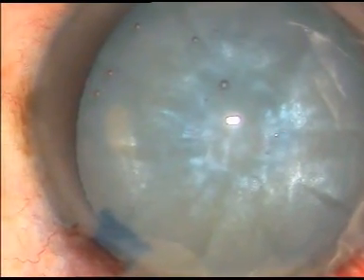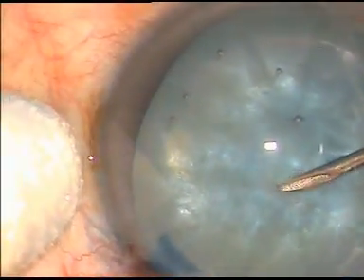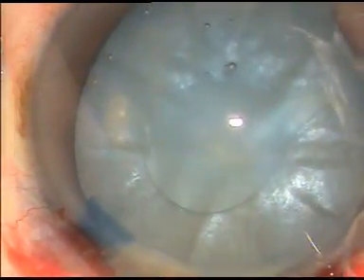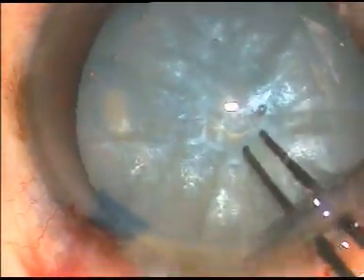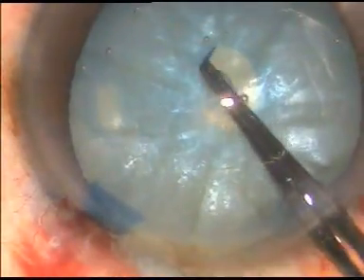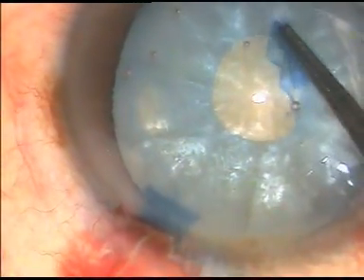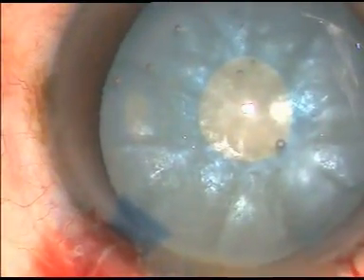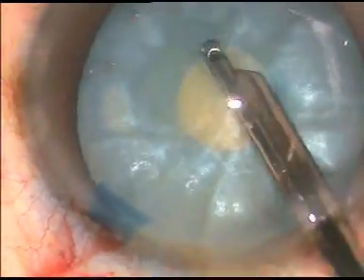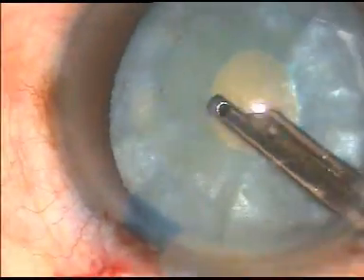A cystotome is taken — a 26-gauge bent cystotome — and a small puncture is made at the center of the anterior capsule. Immediately, as the fluid comes out, a very small rhexis is made with the help of a utrata forceps. I don't try to make a bigger rhexis initially. The high intralenticular pressure is then decreased by aspirating some superficial cortical fibres.